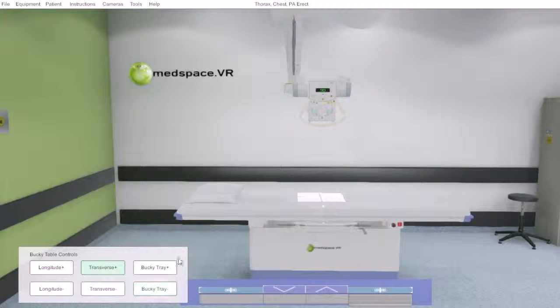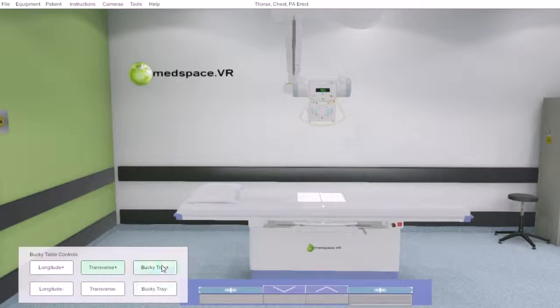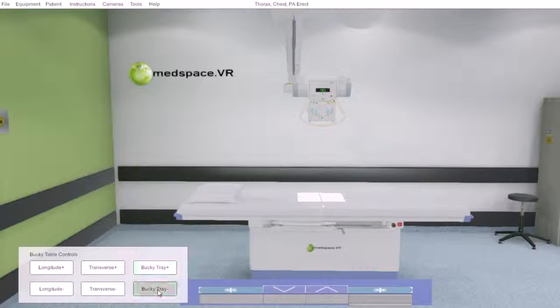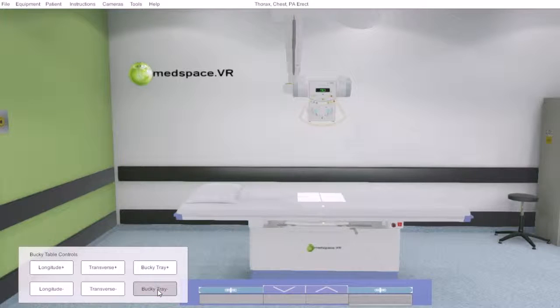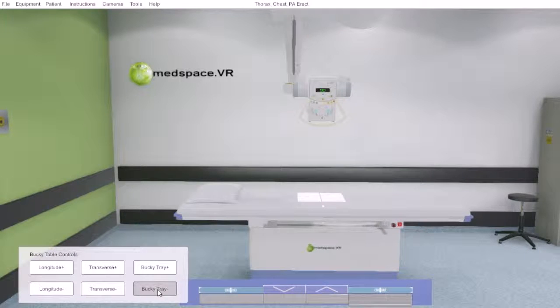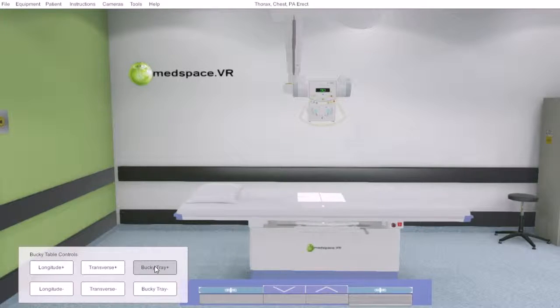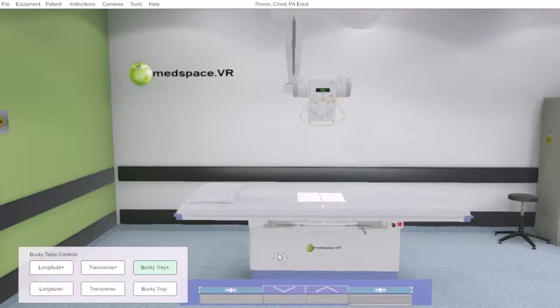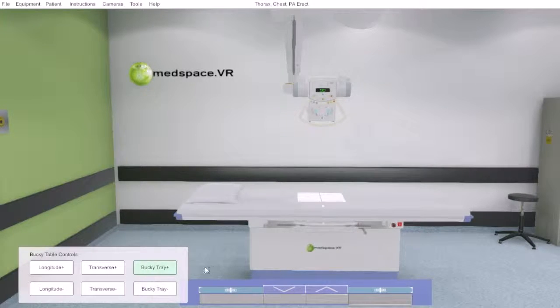We also get access to the bucky tray, which can be moved longitudinally underneath the table. You can see that I am depressing the left mouse button and holding it down, and then it locked that bucky into position.